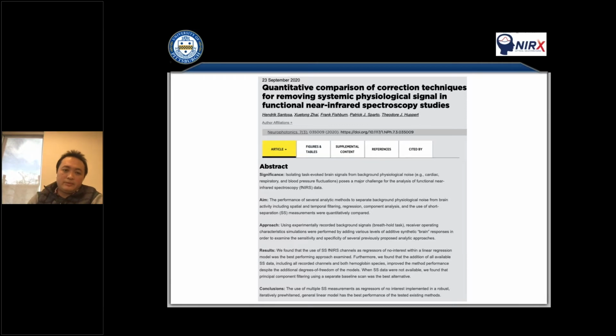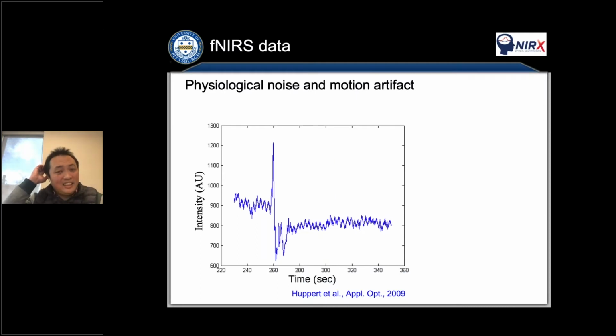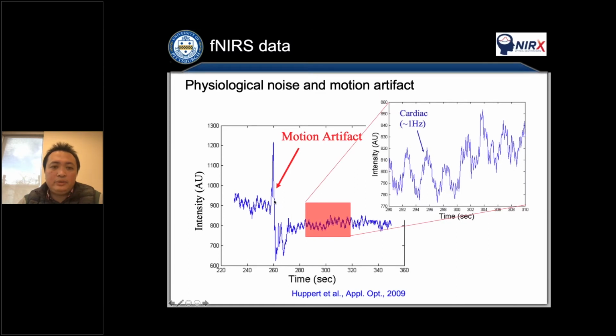For detailed equations and all detailed information. And this is typical NIRS data. You can see a little bit of motion artifact, the outliers, little bit of spikes, and if you zoom, you can see the cardiac around 1 Hertz.